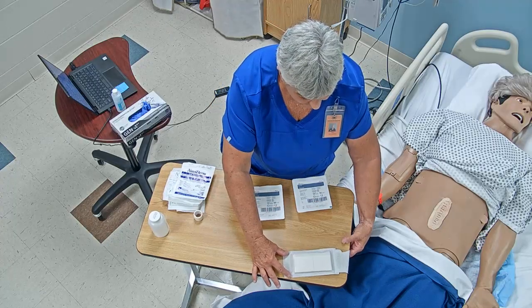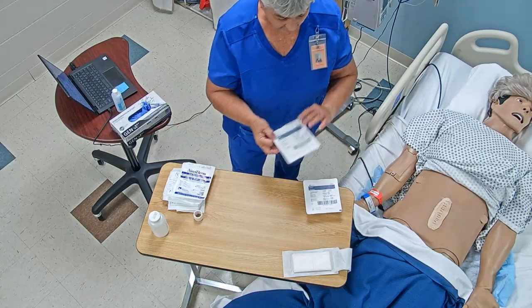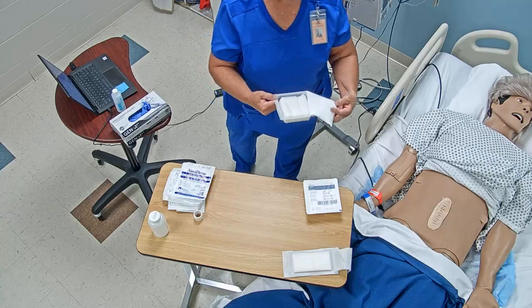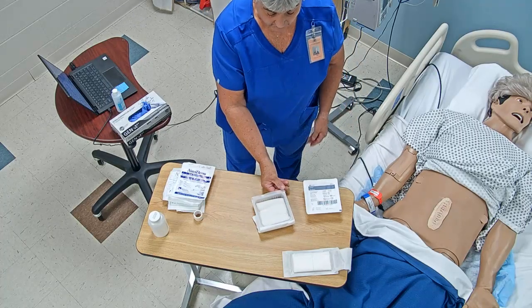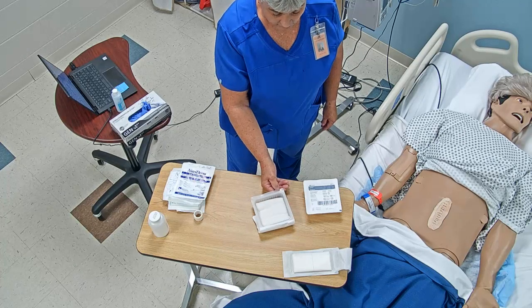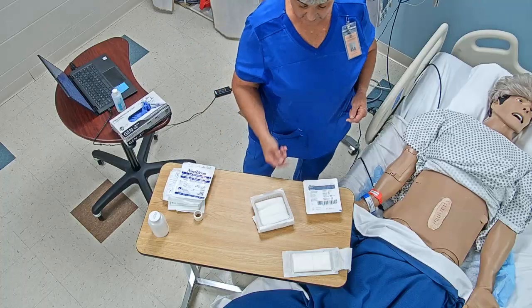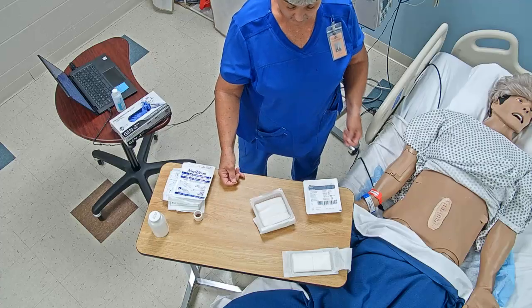Okay, and so that's the last thing I'm going to use, so it's going to be the furthest thing away from me. And then of course with my 4x4s, you're going to open away so that you can make sure that the items stay sterile on the inside. I'm just going to move that back. Now you need to make sure that when you're touching here that you're just touching around this edge right here, because that part right there where it just came unsealed is not sterile. It's the inside that we want sterile. So I've got to make sure my thumb doesn't cross over into the sterile part of that, okay?